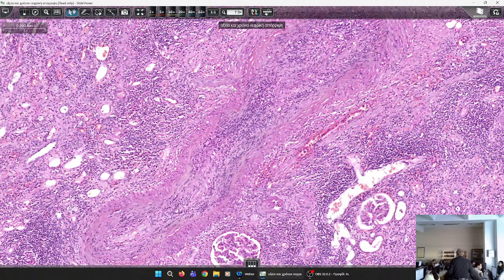So what's happening here? What is this structure being invaded by these immune cells? Yeah, an artery. This is vasculitis. This is vascular rejection, which is some sort of acute rejection. Here it is on a chronic rejection base, anyway, and it is quite severe. It's not the same type of rejection if you just see dense lymphocytic infiltrates.